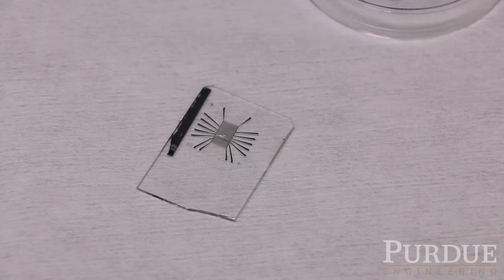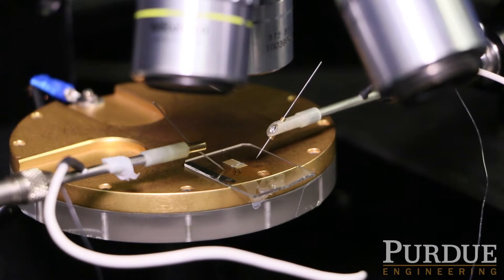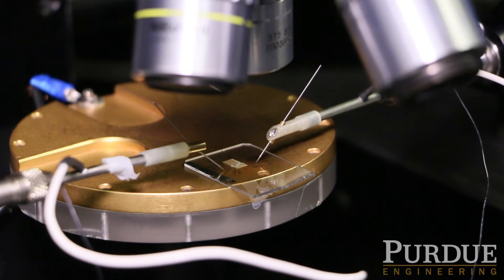The sensor structure is designed in such a way that it holds the droplet in place so the droplet doesn't move. We showed that this pinning of the droplet in place is very important for robust measurements, so we have very small data variation and very small noise.